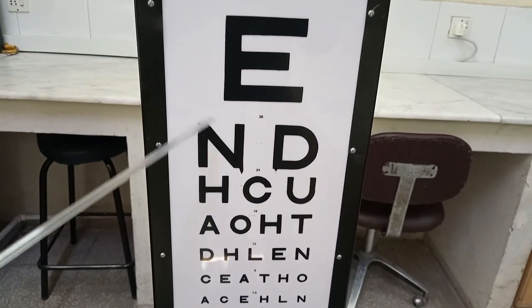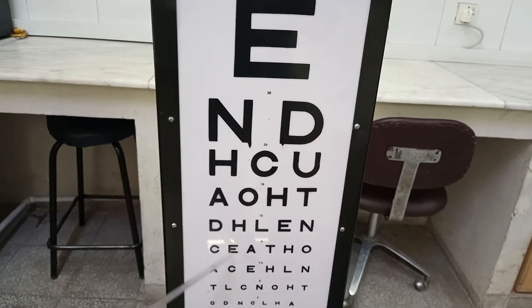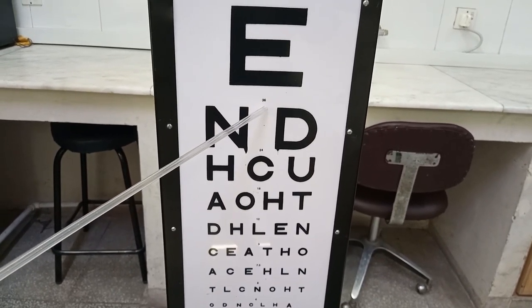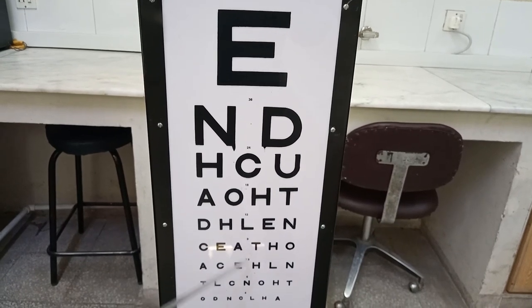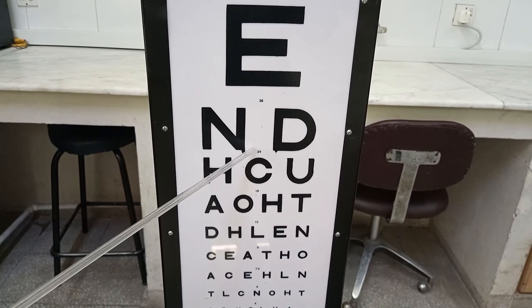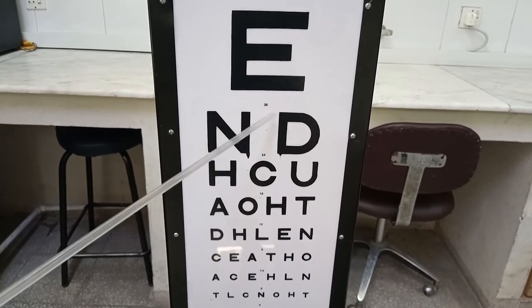We have different lines of letters. Each line is different from the other one in size. There is a figure, a number, that is written along each line. And this number indicates the distance at which a normal person will be able to see the line.